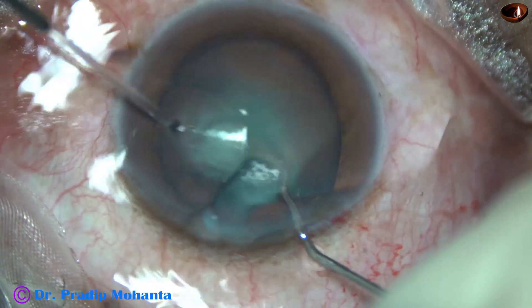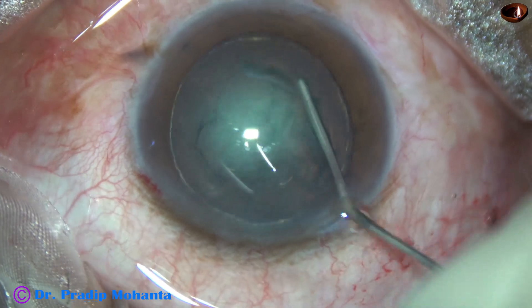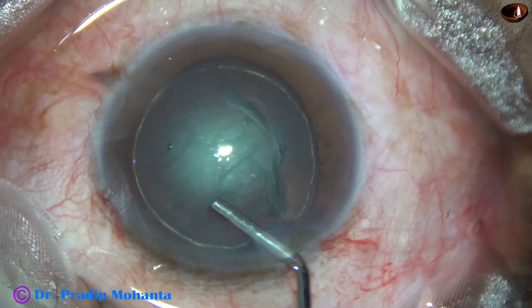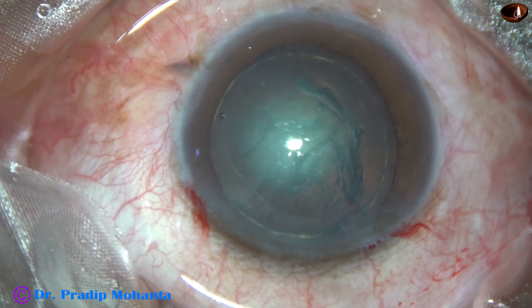Hydrodissection is done with BSS with a 27-gauge cannula. As the fluid wave goes to the opposite equator, the nucleus is stabbed and rotated. The anterior chamber is again filled up with viscoelastic.